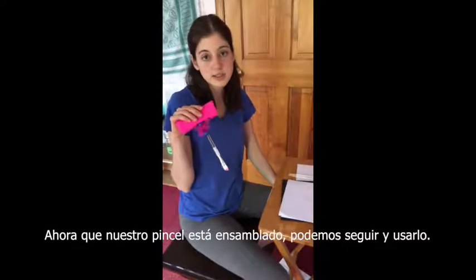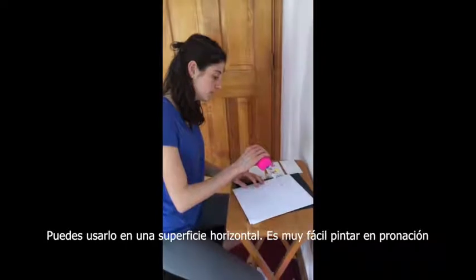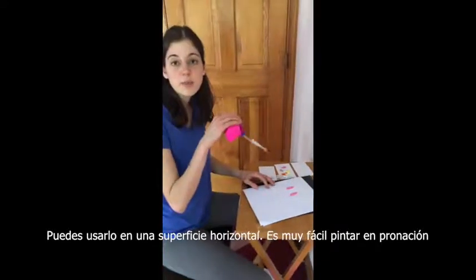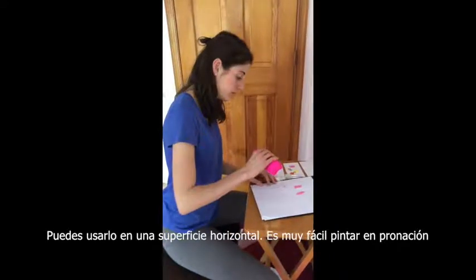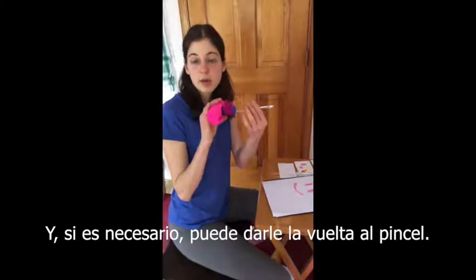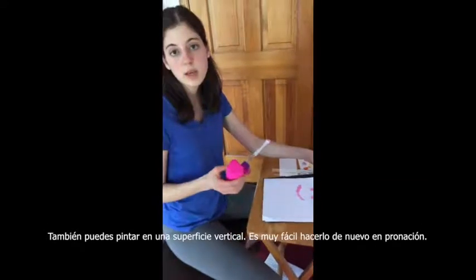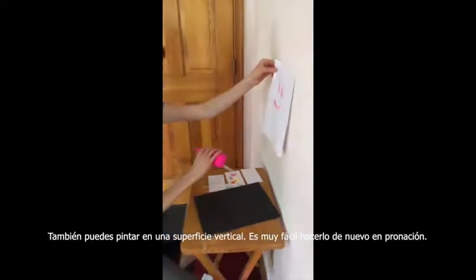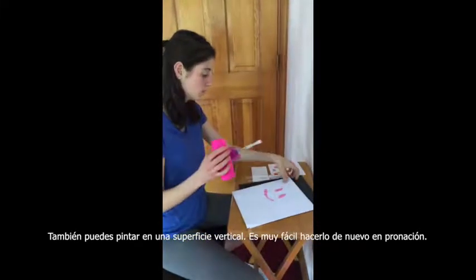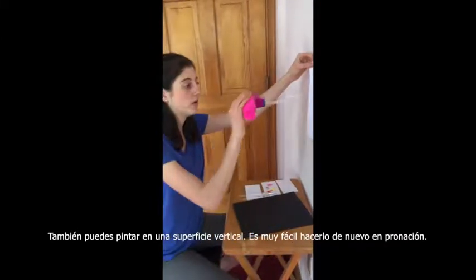Now that the paintbrush is assembled, we can go ahead and use it. You can use it on a horizontal surface — it's very easy to paint in pronation — and if needed you can turn the paintbrush around. You can also paint on a vertical surface, which is again very easy in pronation.